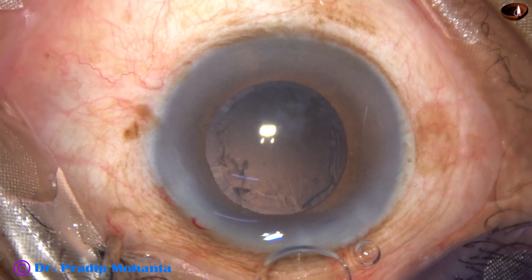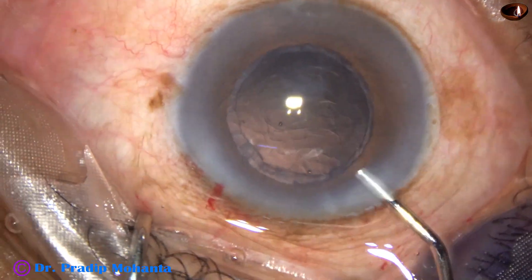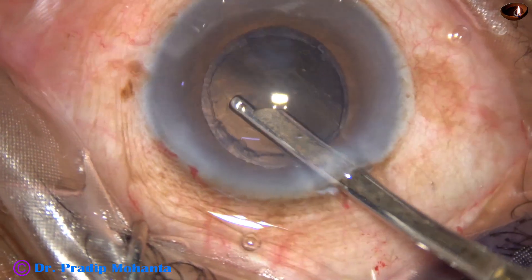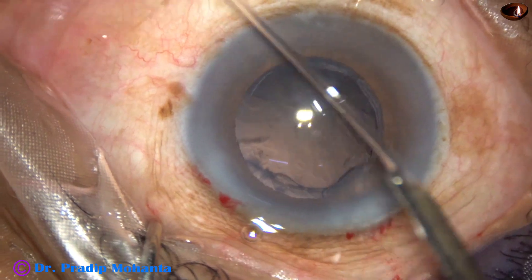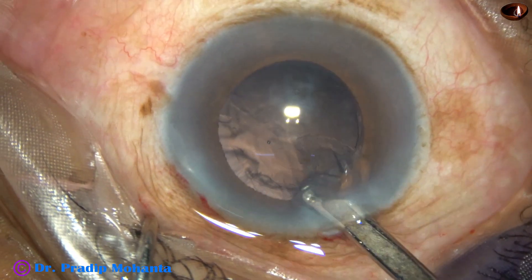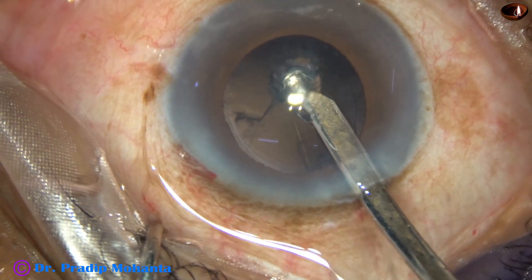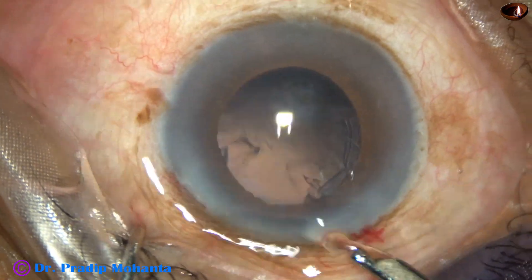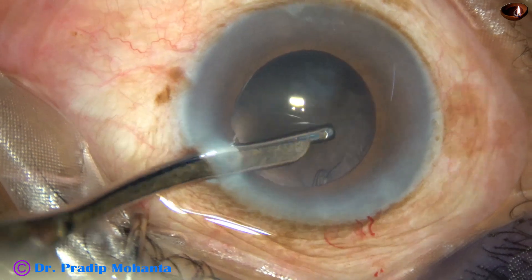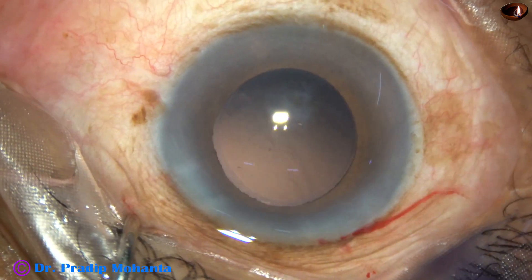The nucleus is now managed. Some cortex remains, so a little more visco is added. A 22-gauge Simcoe cannula goes through the main wound. Cortex from 3 o'clock to 6 o'clock is removed, then 6 o'clock to 8 o'clock, then cortex from 2 o'clock, then from 2:45 o'clock. Going through the side port, cortex from 9 o'clock to 12 o'clock is removed, completing cortical cleanup.